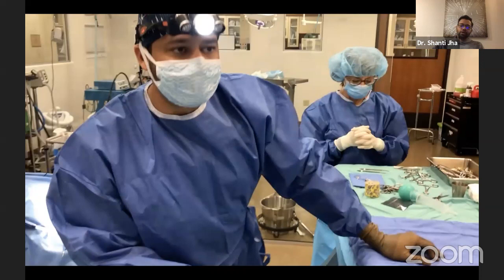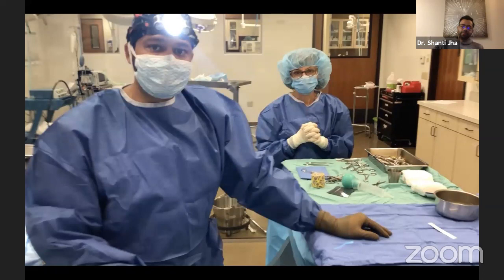Okay, so the patient is all set, draped. The person behind me is here just to learn. She's interested in orthopedic surgery, a local veterinarian, so I invited her to come see the fracture repair. All right, so we are all ready. Exposure is done, and now we'll put a plate.